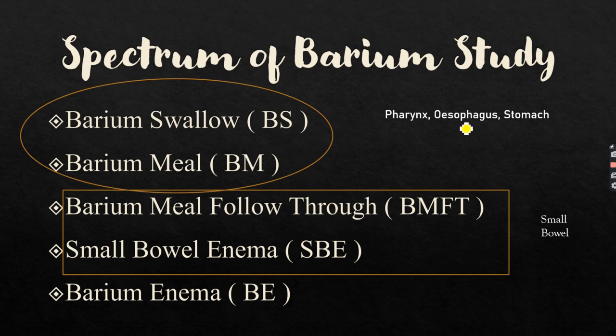The more proximal the pathology is, prefer barium swallow. If esophagus, you can go for both depending on the indication. And for the stomach, let's say the antrum part or duodenum, the barium meal is preferable, right?